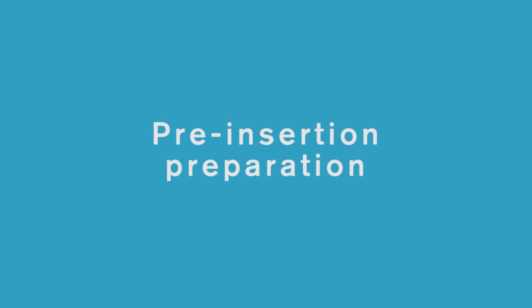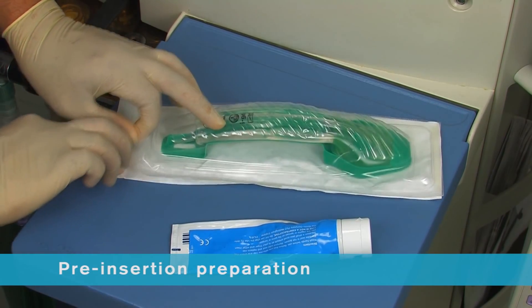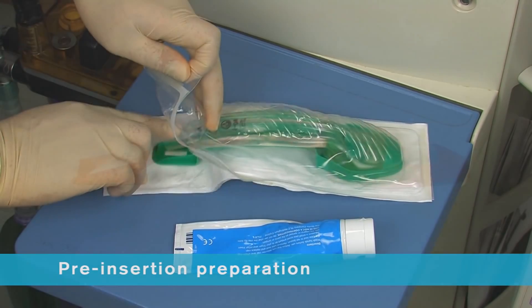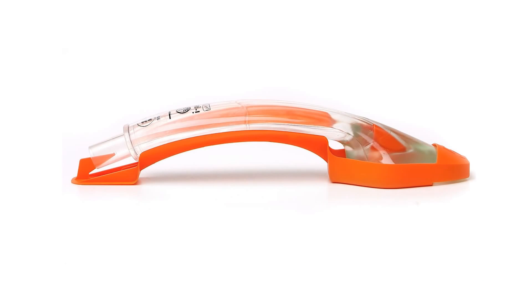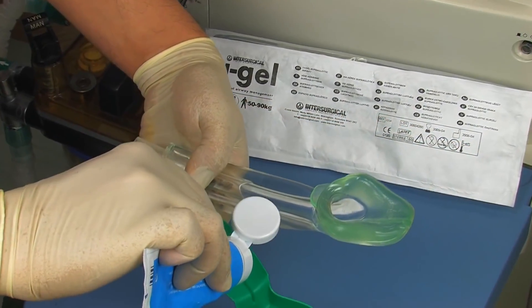iGel is supplied in a sterile pouch enclosed in either a protective cradle or a cage pack. This innovative packaging is colour-coded for size and designed to ensure the device is maintained in the correct flexion prior to use. It also acts as a base for lubrication.